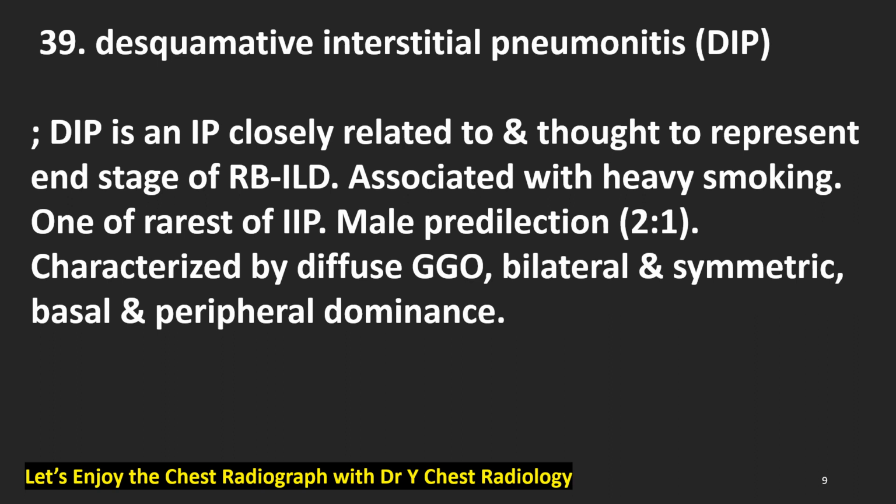It shows male predilection. It is characterized by diffuse ground glass opacity, bilateral symmetric dominance, basal and peripheral dominance. Can you imagine the findings?